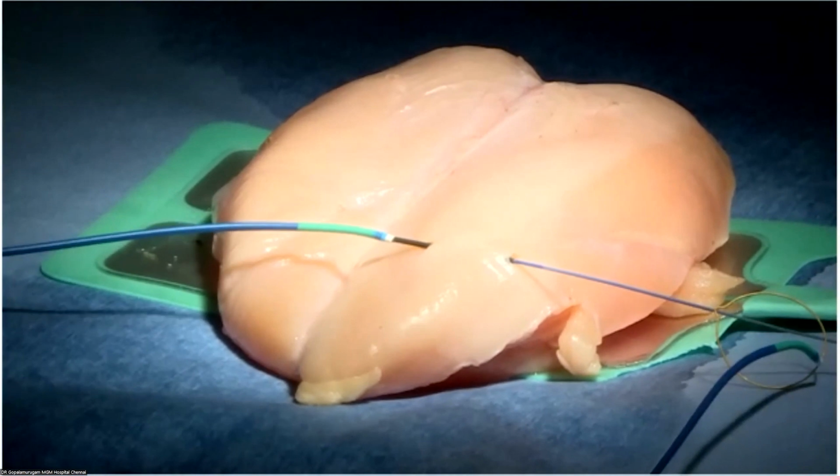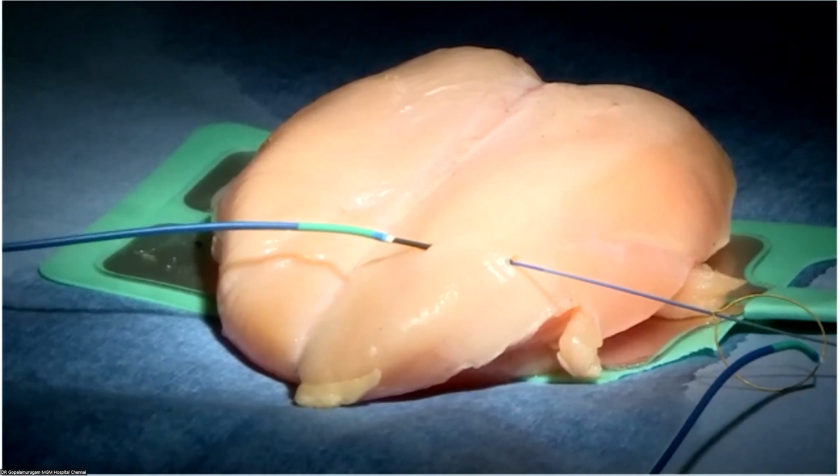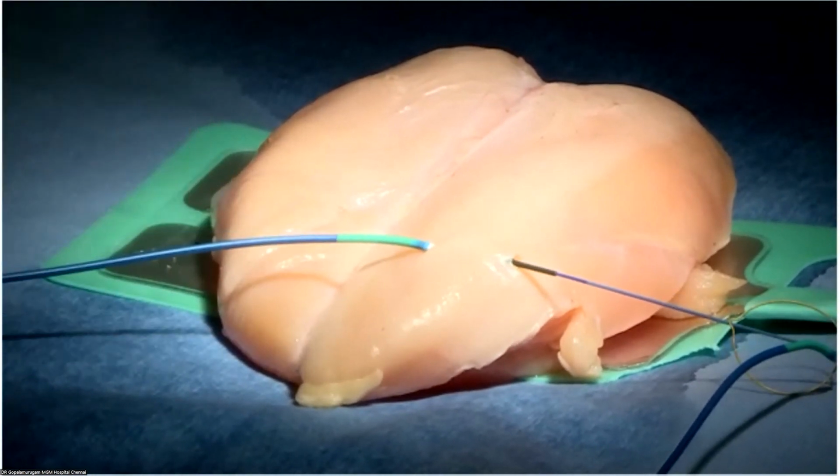I think this is a great improvisation using the equipment that we have. So that's just to demonstrate, because we don't have the piggyback wire converter. I think this is a good way where one can use this, not just for transcaval and also for congenital cases via pulmonary windows. So I hope these 3 examples, Lampoon, Basilica, and transcaval, demonstrated some electrosurgery, and this was useful.